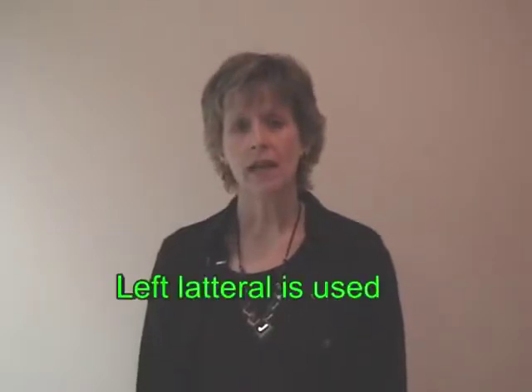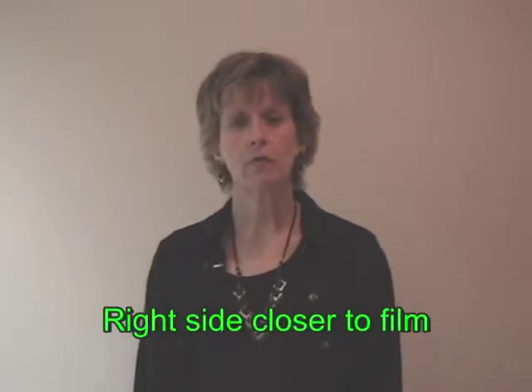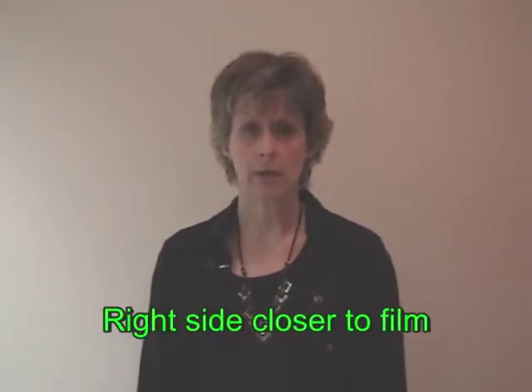The rationale behind that is if there is no symptoms or no history, the left lateral is used to get the heart closest to the film. It will be less magnified that way. The heart is a main focus area. However, if there's history of pain, say, on the right side, we need to get the right side closer to the film for the lateral, as it will be better demonstrated. So 80% of the time it's probably a PA and a left lateral, 20% of the time PA and right lateral, and the only way you'll know for sure is if you ask your patients.